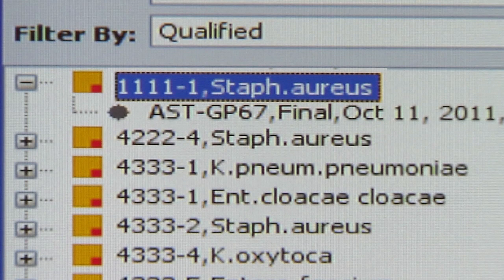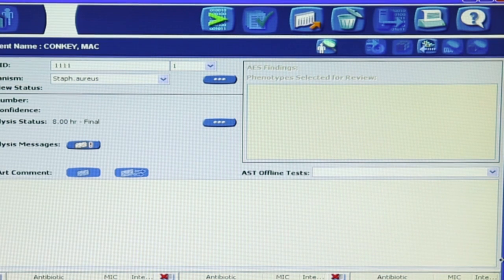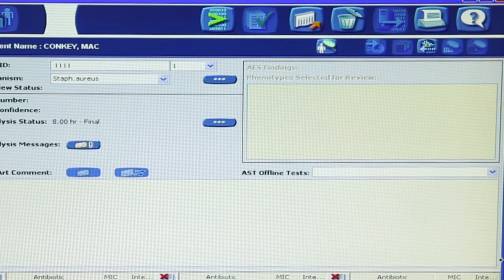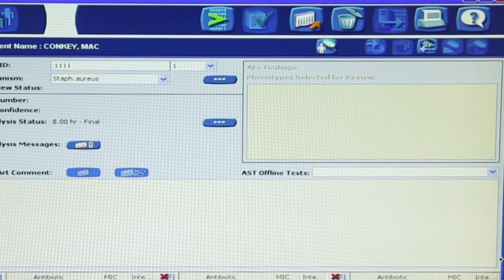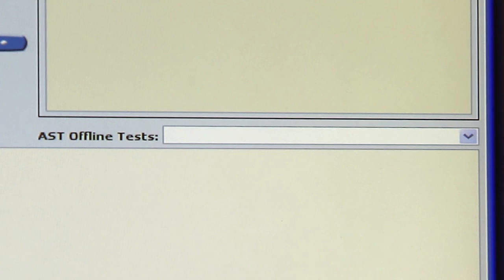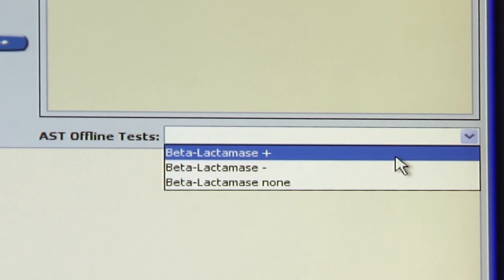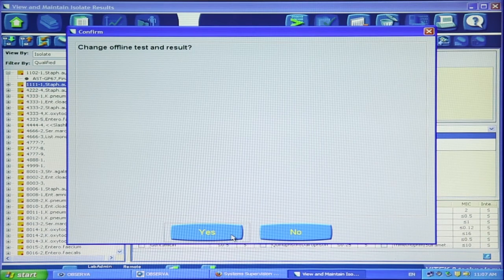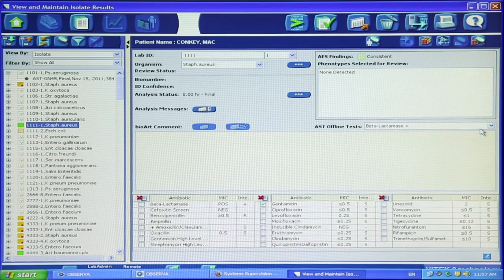Next, let's look at issues related to the AST analysis. Is this an AST GP test card? If so, has the beta-lactamase test result been entered? In addition to the internal tests included on the card, certain AST GP test cards require a beta-lactamase result in order to complete the analysis. In the middle right-hand side of the results window, click the beta-lactamase field to display a drop-down list of result choices. Click to choose the appropriate result. The software will analyze the results automatically once the offline test is entered.